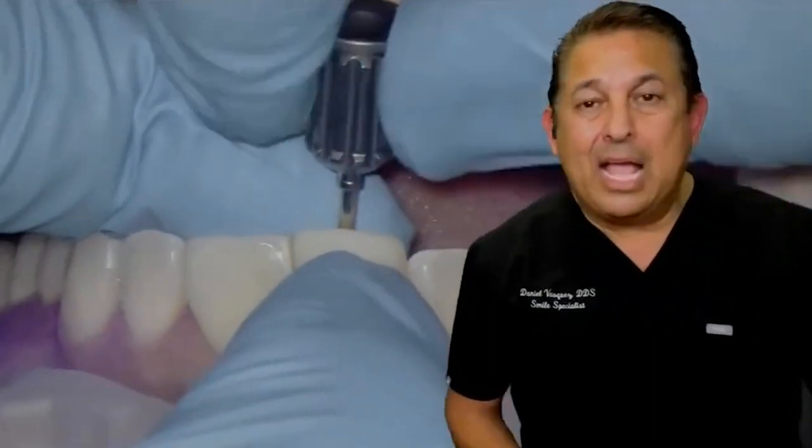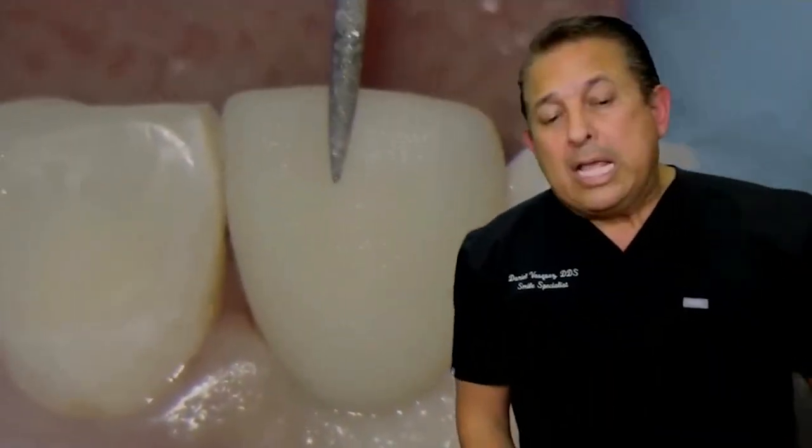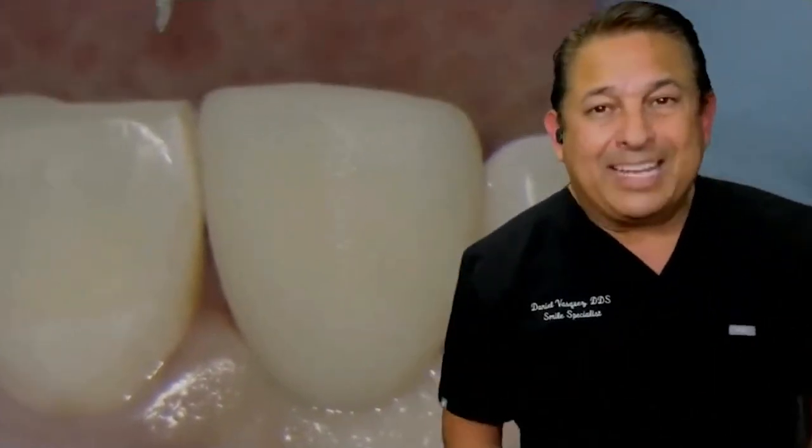It's beautiful. And this is not an immediate load, because I will take a little off from the contact, and there's going to be absolutely no contact with the lower incisors. So, yes, let's shape it. Let's give form, shape it. Let's make it look like a tooth.